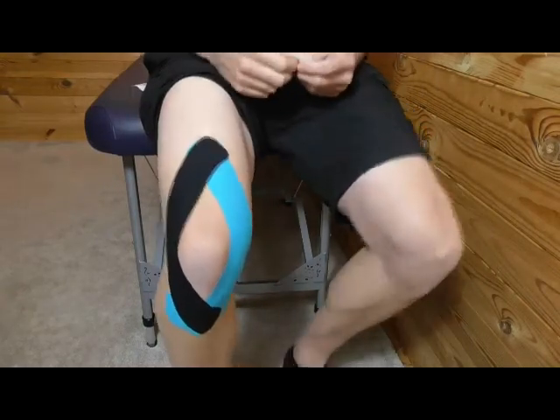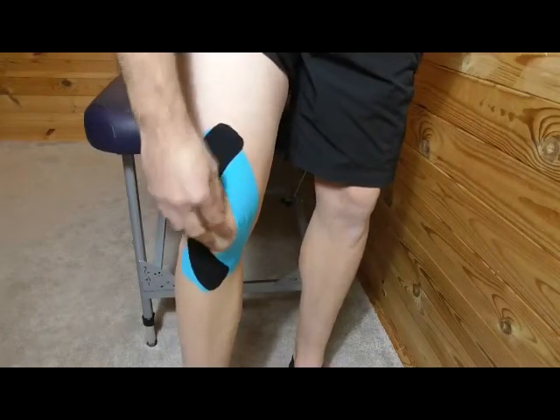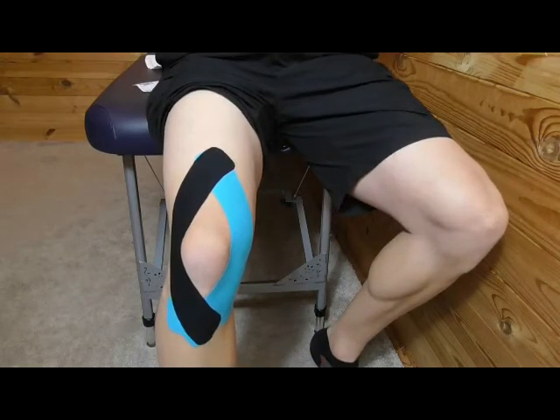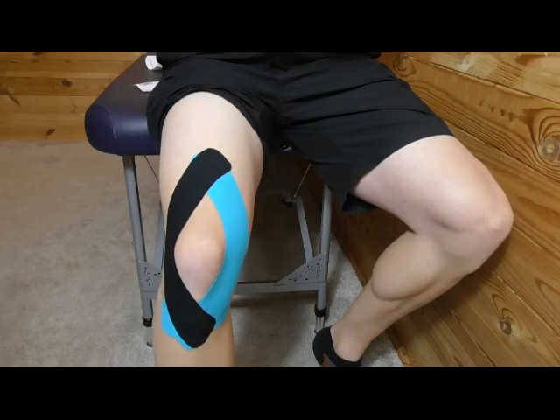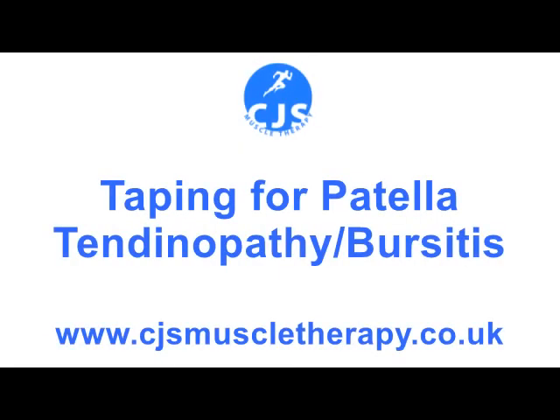And you're done. When you stand up, you should have a slight crinkling on the knee. That is kinesiology taping application for patellar tendinopathy or bursitis. Thank you very much.